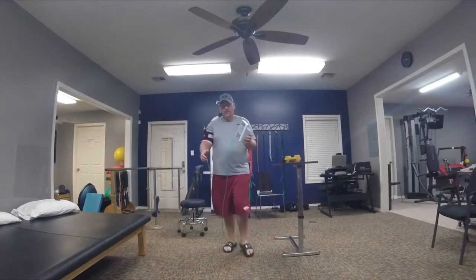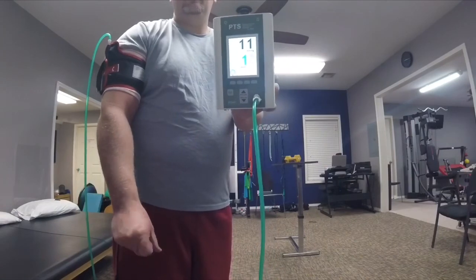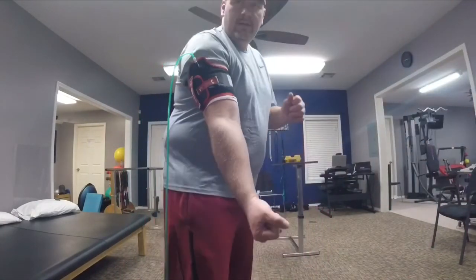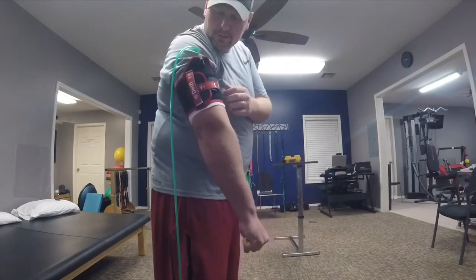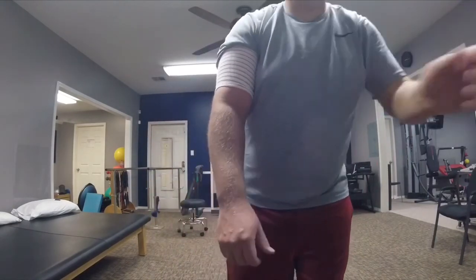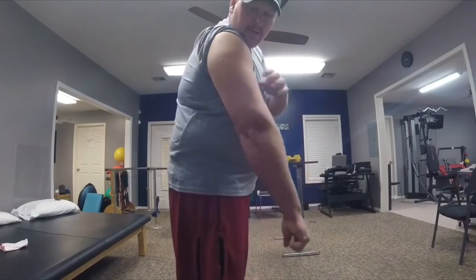So, the machine now is counting down, and it released, and oh my goodness, relief. Oh, wow. That is relief in the bicep, in the whole arm. Oh, goodness. So, that is blood flow restriction training for upper extremity.